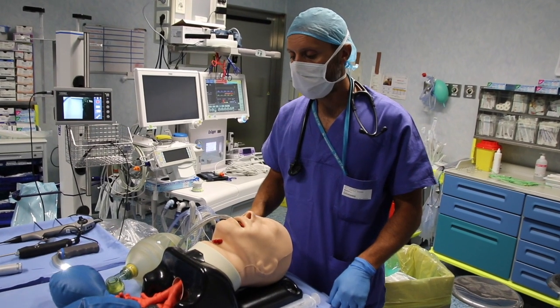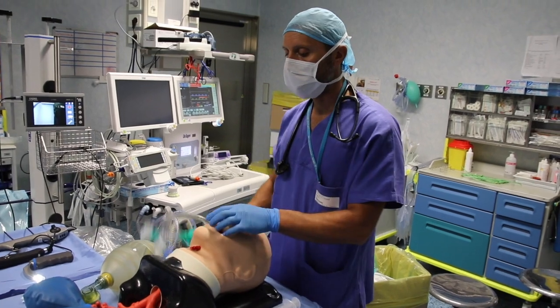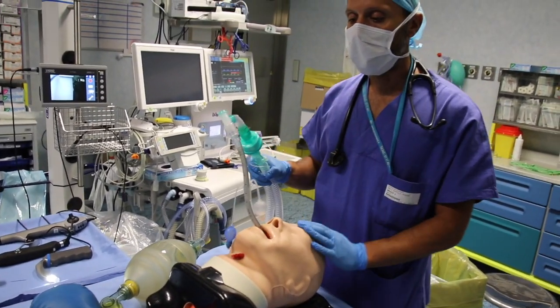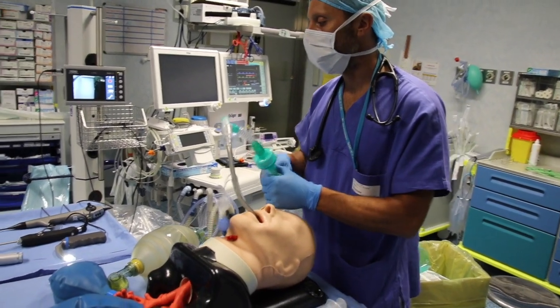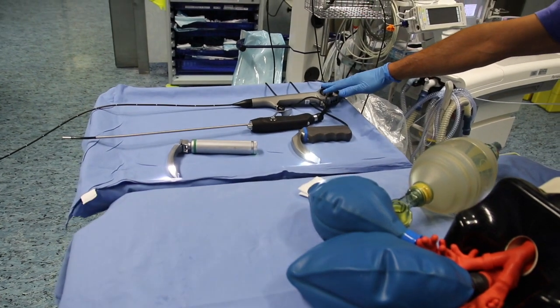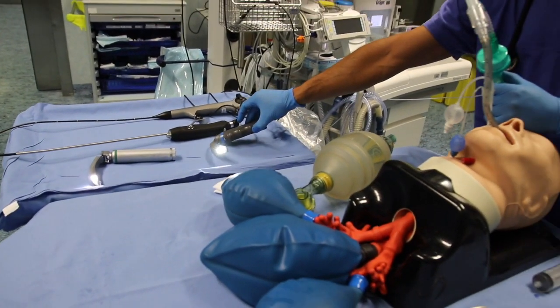Now we are going to intubate the patient. The patient is under supraglottic ventilation, connected to the ventilation circuit. We can choose to intubate with any available optical device. In this example, we'll be using a video laryngoscope.